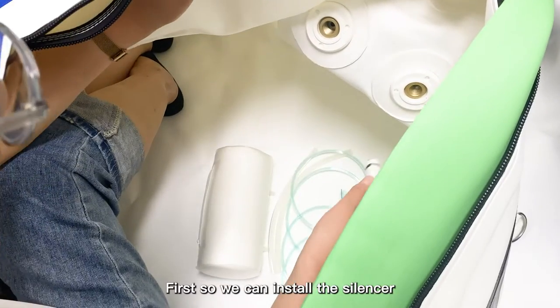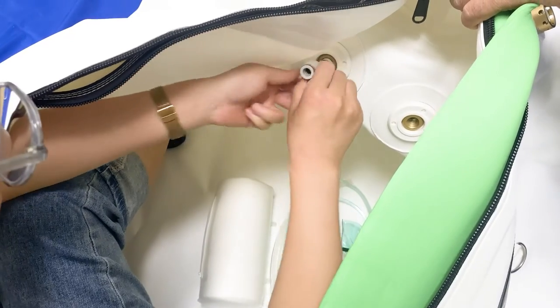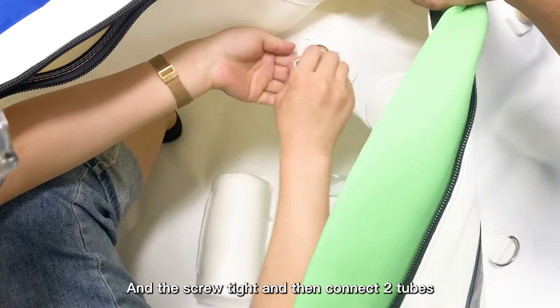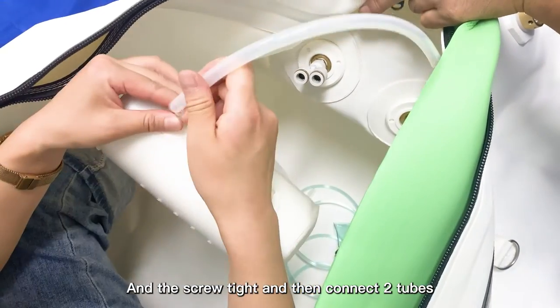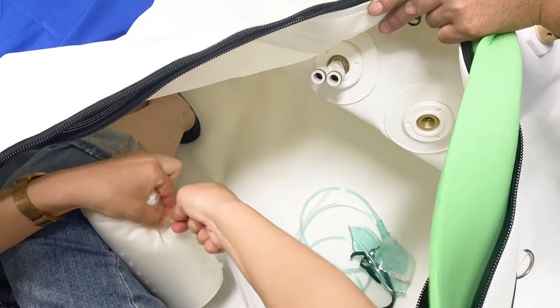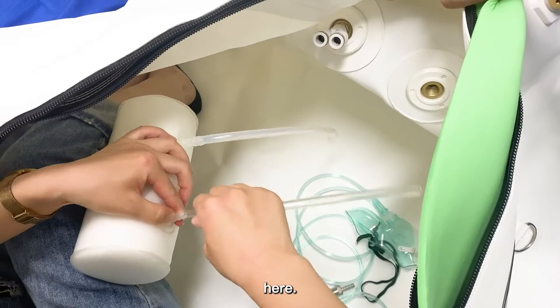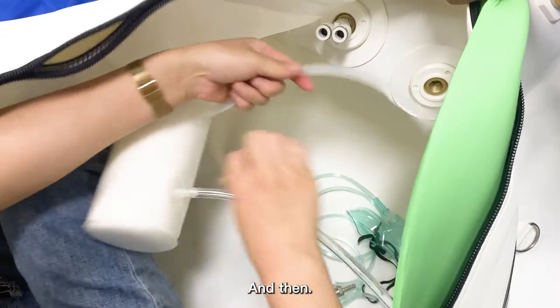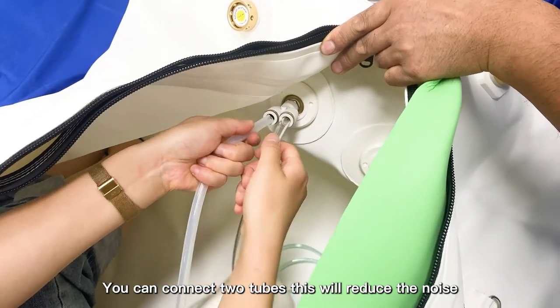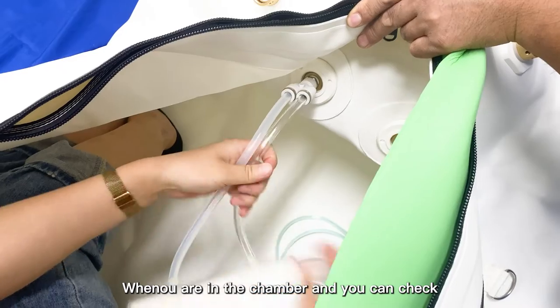First, we will install the silencer. Connect the silencer here and screw it tight. Then, with these two tubes, connect them here. You can connect the two tubes — this will help reduce the noise when you are in the chamber.